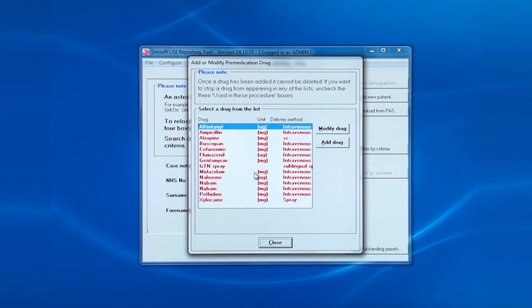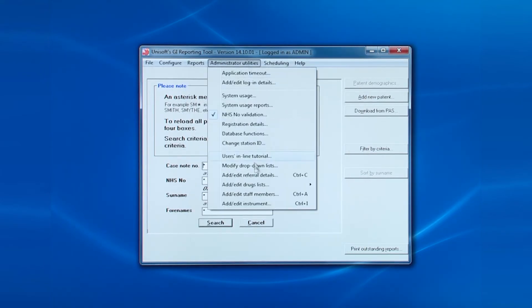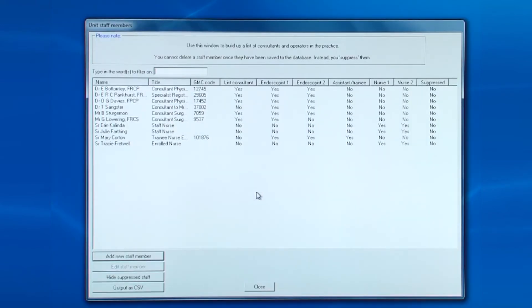We'll close this window and now go to the penultimate entry: add, edit staff members. Here's a list of the staff who work and assist in the endoscopies.